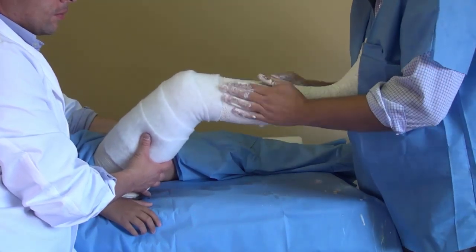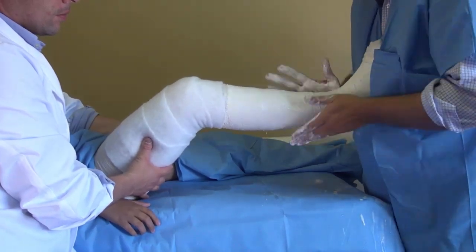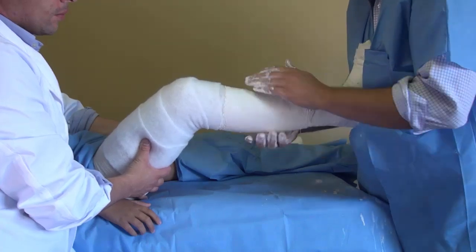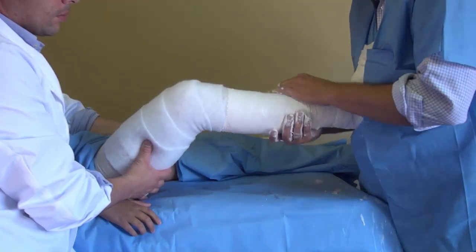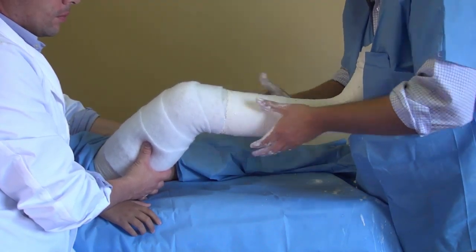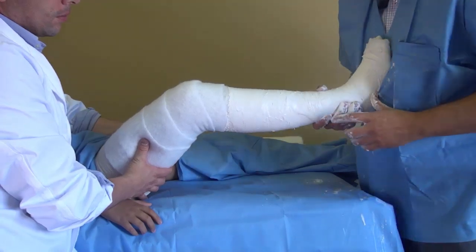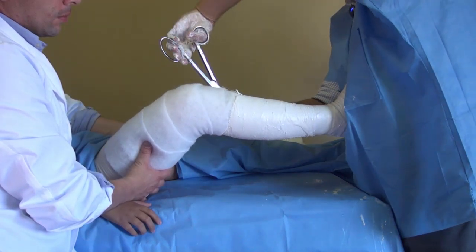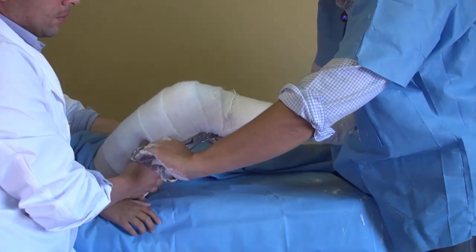This is the time where you can take out the air bubbles and do the molding. Be sure to mark the malleolus. You must never forget, before this gets dry, to make a couple of cuts so the leg won't be in danger of neurovascular problems due to compression. So take the scissors and cut anterior, medial, lateral, and then posterior.